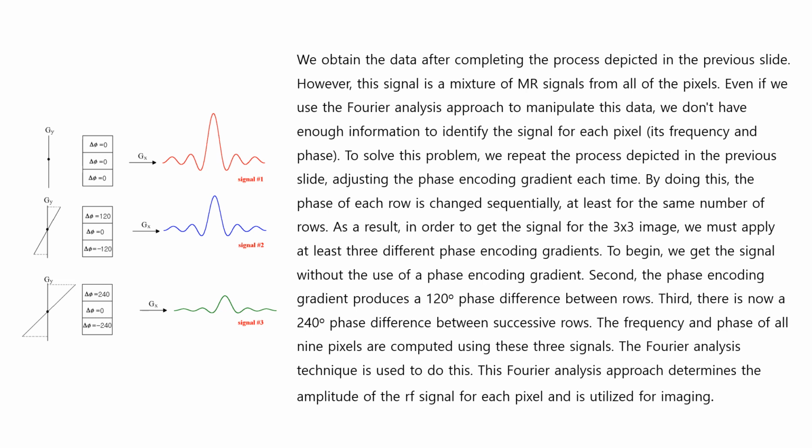Still, we have a problem because we obtain the data after completing the process depicted in the previous slides. However, this signal is a mixture of MR signals from all of the pixels. We cannot measure the signals coming from each pixel. We just measure the signal coming from all pixels together. Right?